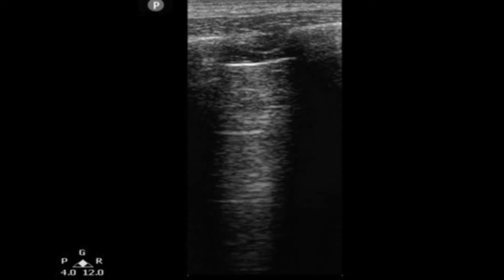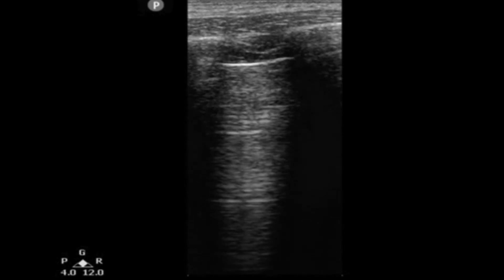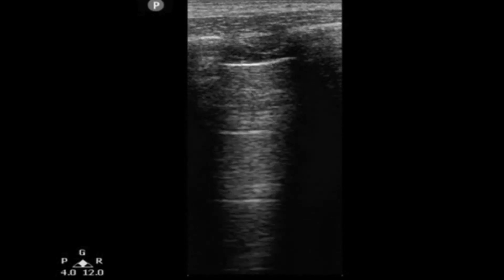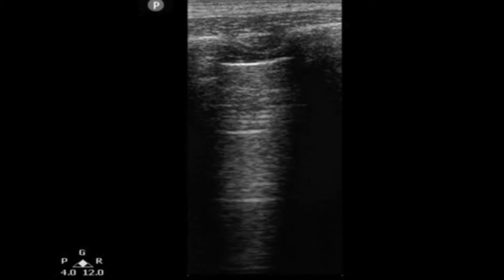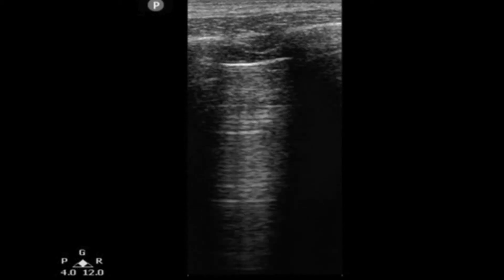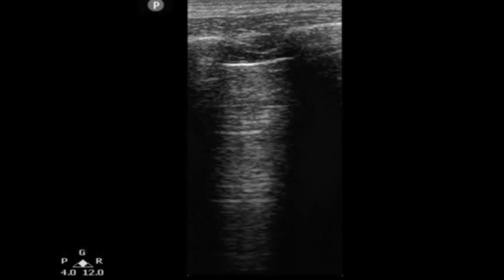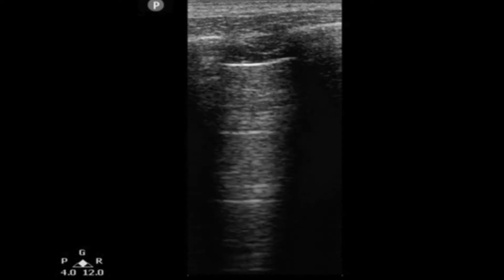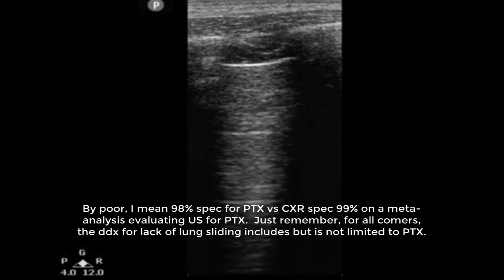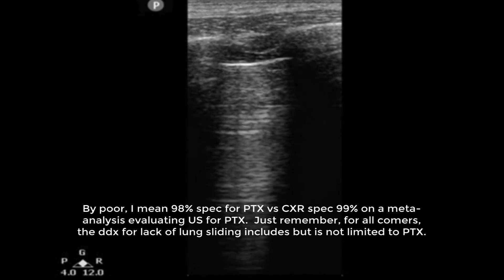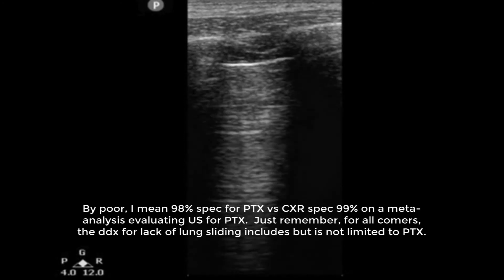This technique is fairly accurate for diagnosing pneumothoraces — it outperforms traditional chest x-ray at least in the supine context. However, anything that prevents movement of visceral and parietal pleura against one another can cause this sonographic finding even without a pneumothorax. If you see lung sliding, there is no pneumothorax at that location. But the specificity is poor due to things like talc pleurodesis causing adherence of the pleural layers, mainstem intubation, or apnea.